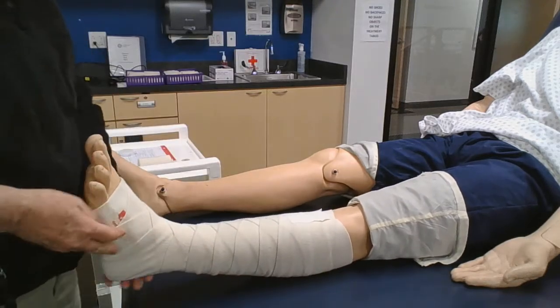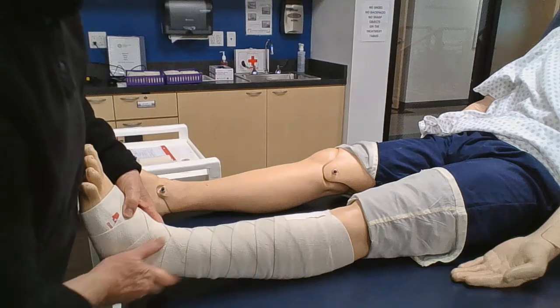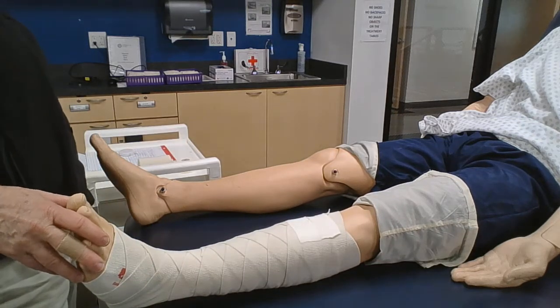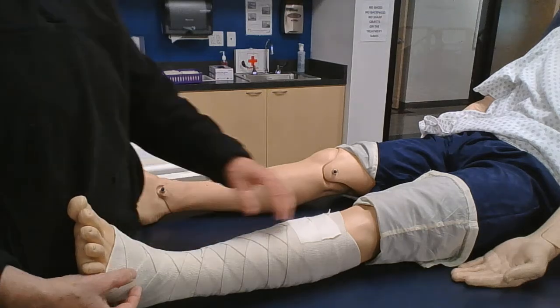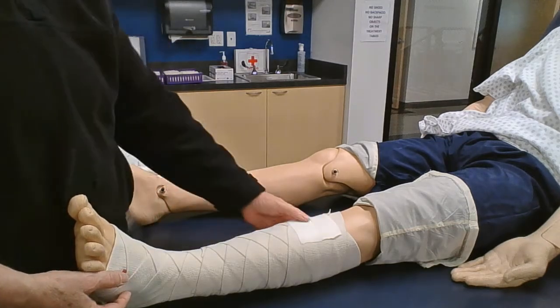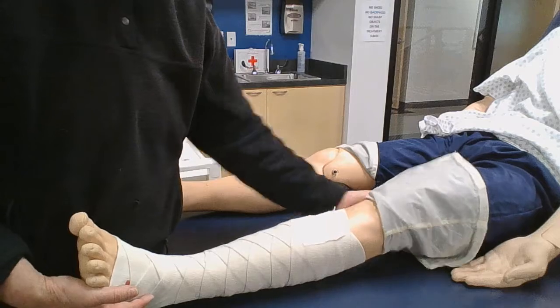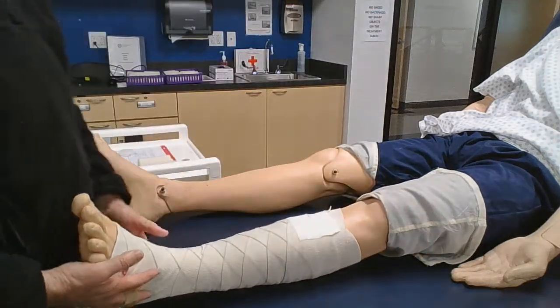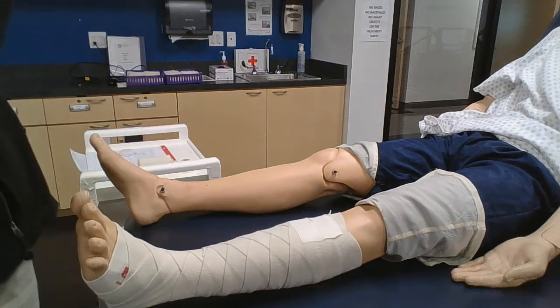Very few wrinkles, no gaps. We checked the heel on the way up. And, okay, we had more pressure here, less pressure up here, just kind of laid it on there. Didn't go into his popliteal area, which is still up in there, okay? So that's an ACE wrap, you guys.